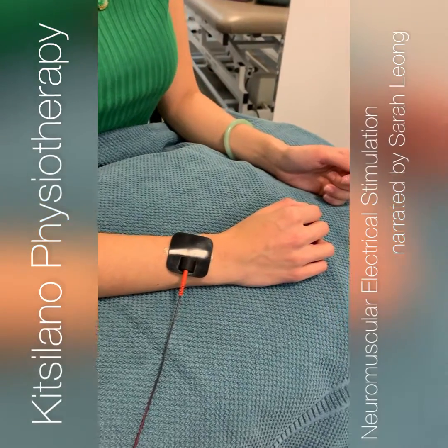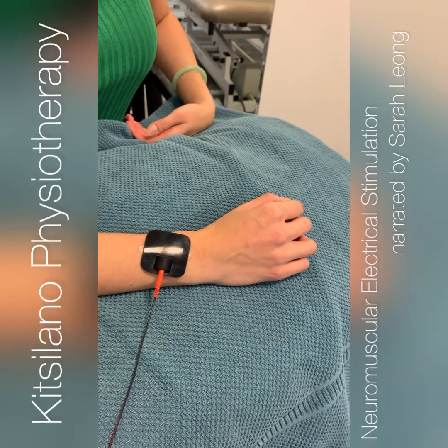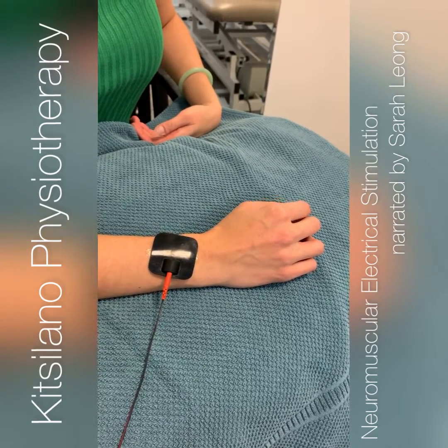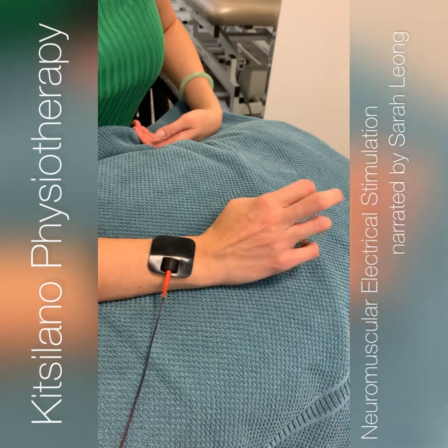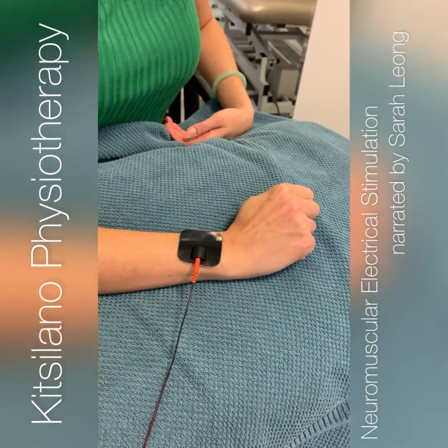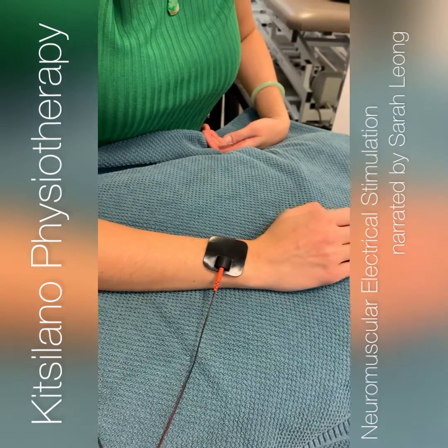Here you'll want to watch her hand. As we turn this one up, you'll see the muscles start to activate. That is actually from the machine itself. Right now we're waiting for the machine to ramp down, and then we can do reps.